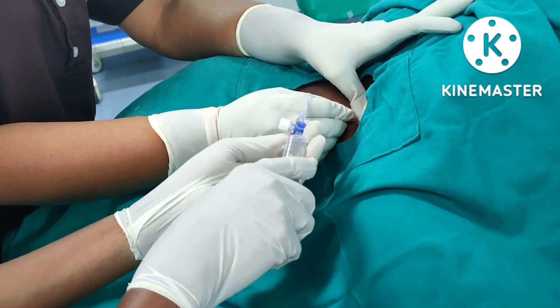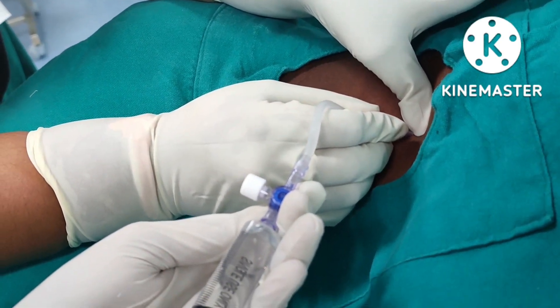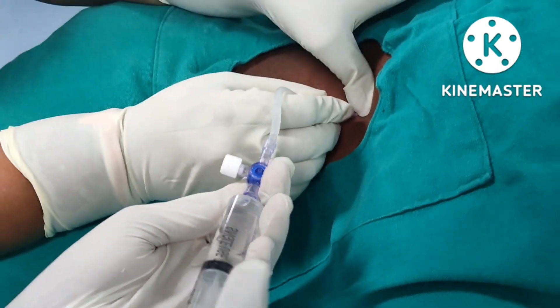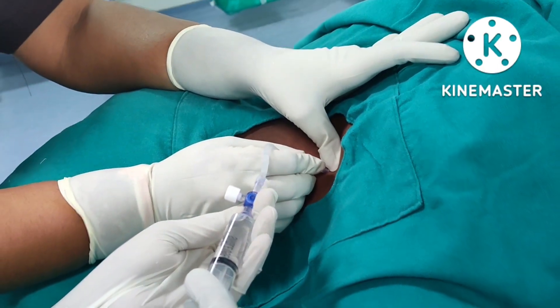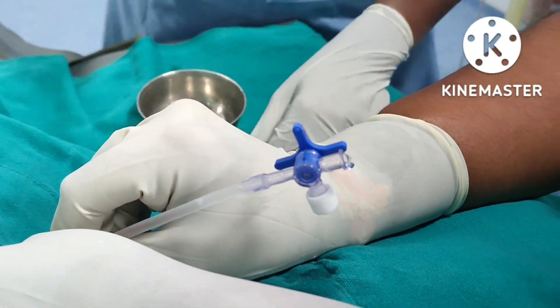Once the patient reports a shock-like sensation in the fingers, I am giving the drug after withdrawing. We can see the free flow of the drug, and now we can see the backflow.